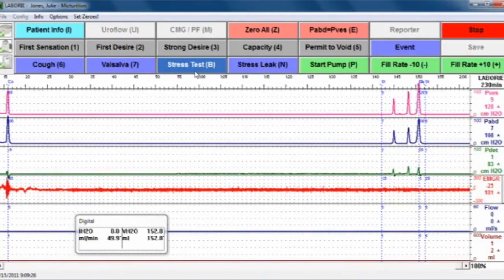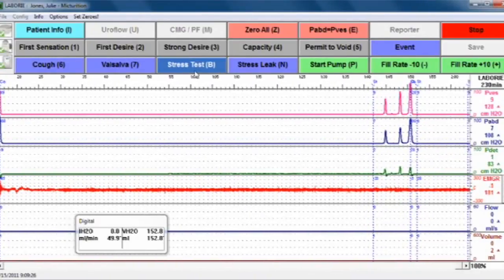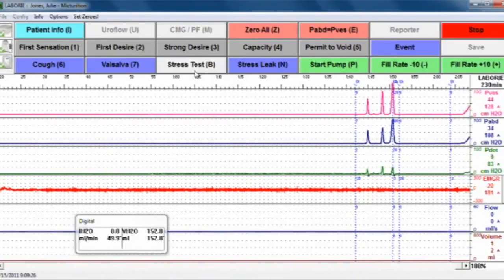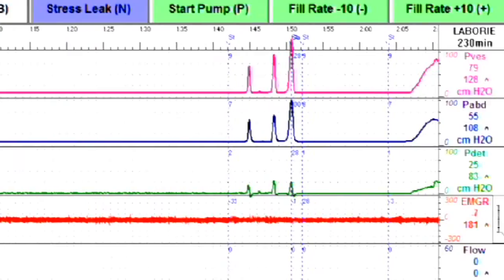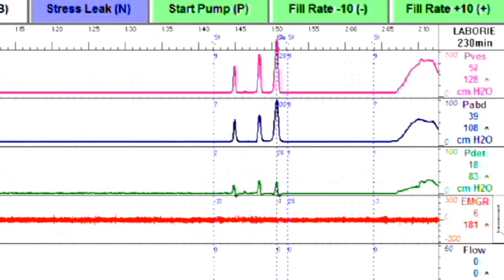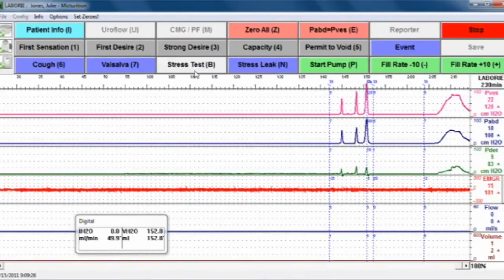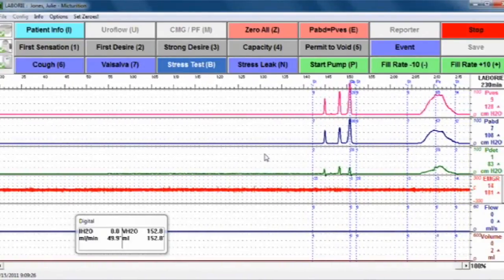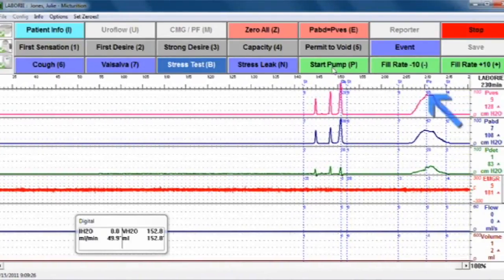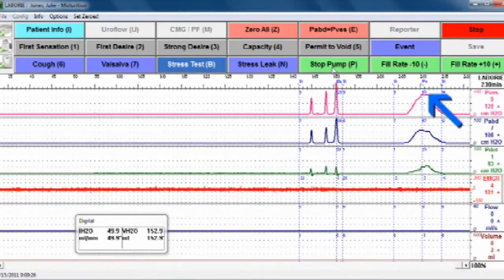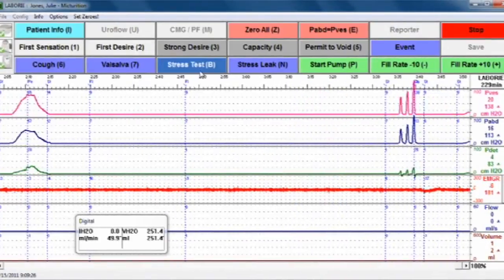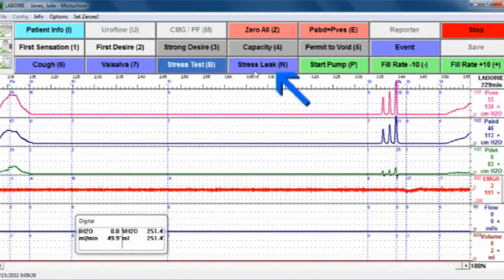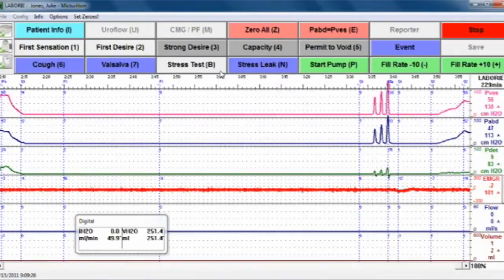You can also ask the patient to bear down — this is called a Valsalva leak point test. The software will again ask you if there was a leak. If you mark no, it will mark the peak pressure with a marking of peak, no leak. You can also mark stress leak at the point when you see a leak, if there was one during the stress test.